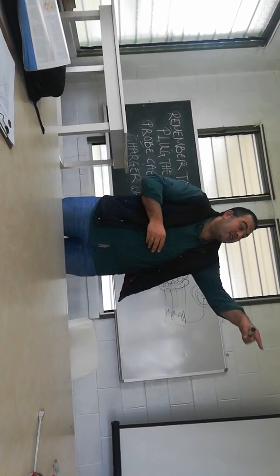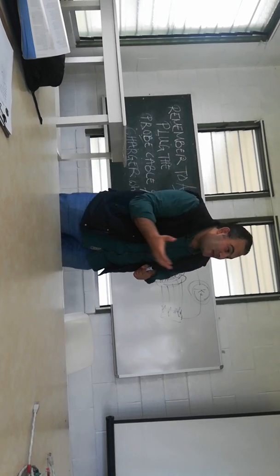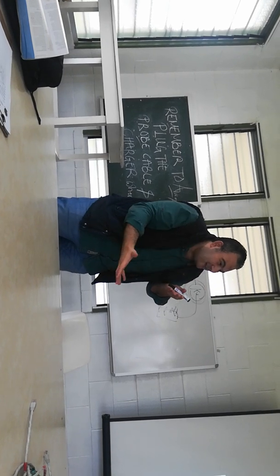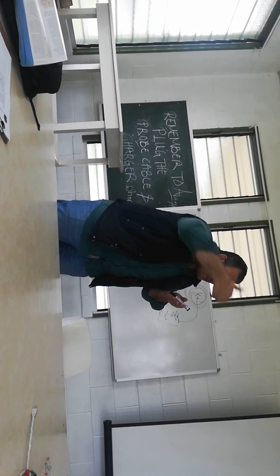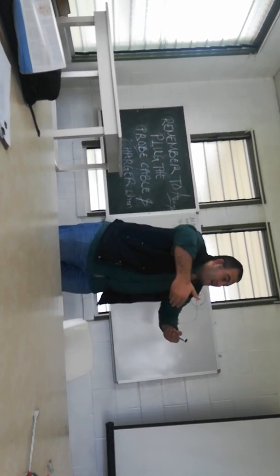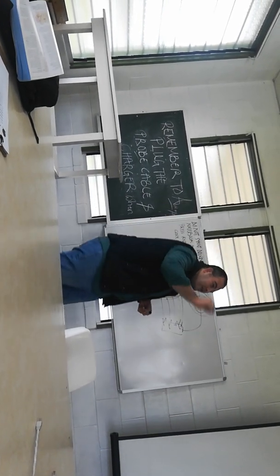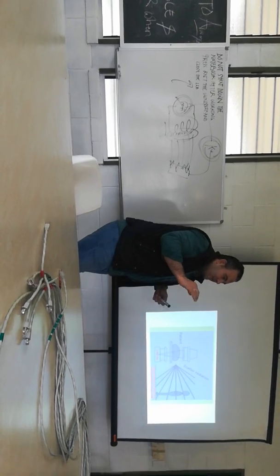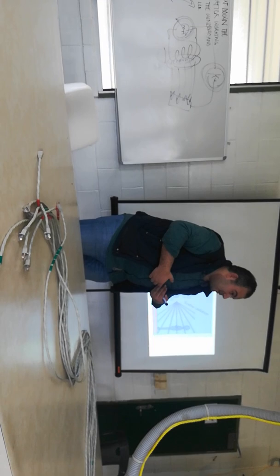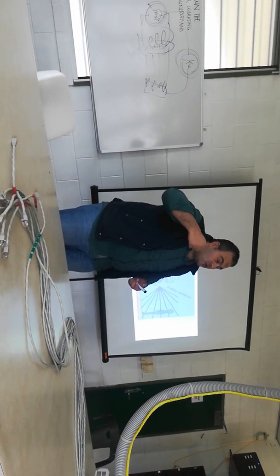If I increase the penetrating power, the absorption will be reduced, so the image will be darker, more black. So is there no need to increase kV? It's a very important question you ask. If I want to image bone or iodine contrast, for example for a patient with barium, for a rectal examination, I have to increase kV.